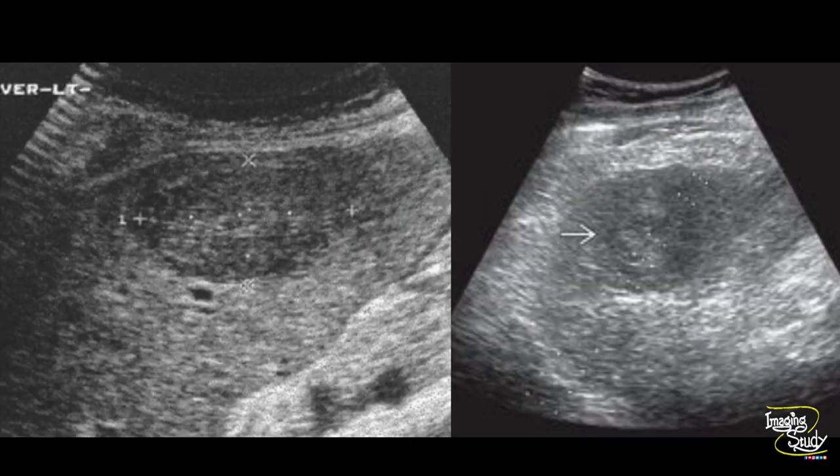Here's an ultrasound picture showing a reduced echogenicity lesion within the left lobe of the liver in a patient with hepatic cirrhosis, which may mimic a tumor. Here is another hypoechoic lesion within the liver parenchyma. Ultrasound-guided biopsy was done to exclude hepatocellular carcinoma and came as dysplastic nodule.